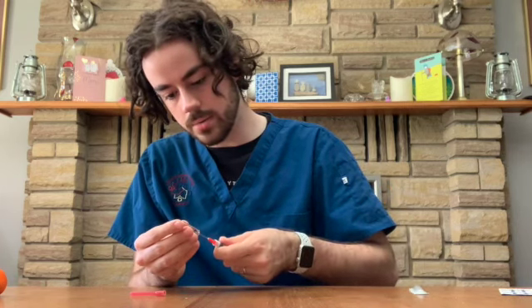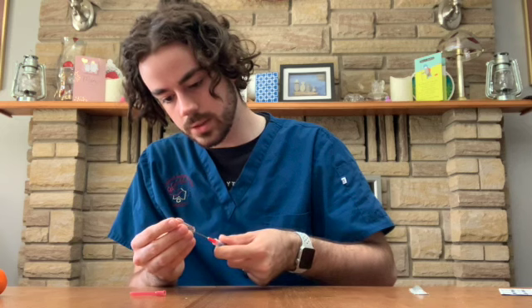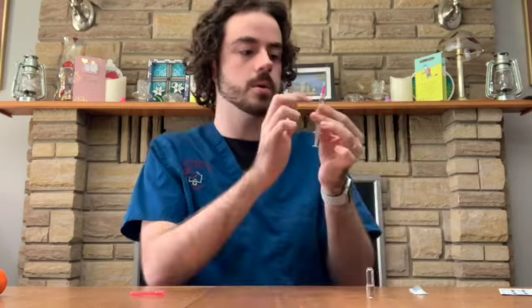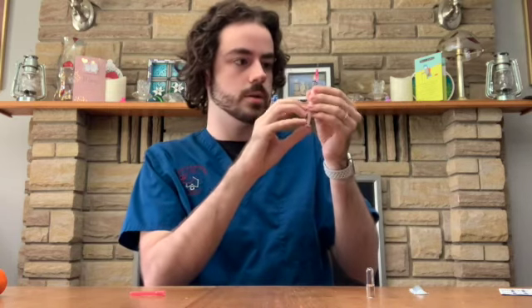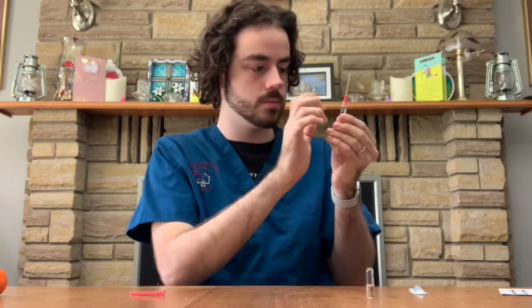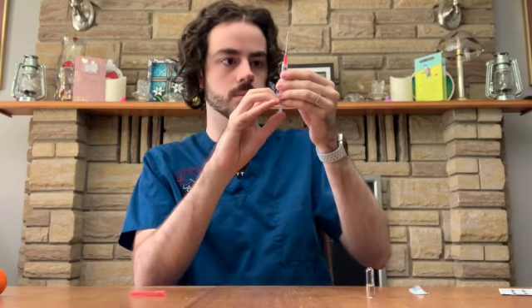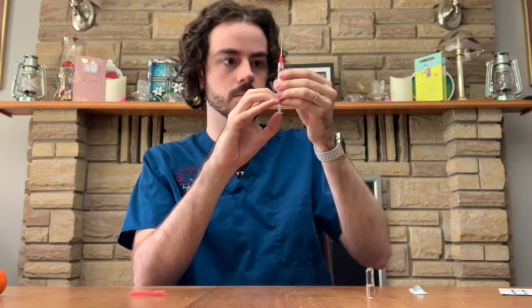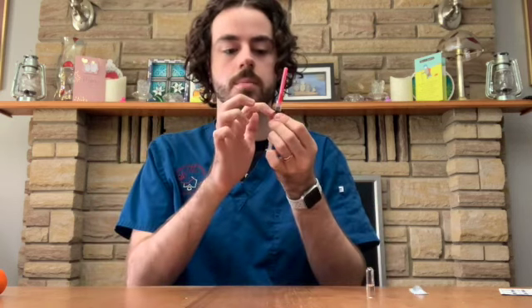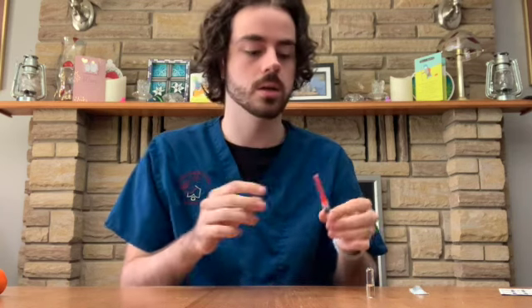And I'll draw up 0.5 milliliters. Just like that. Ensuring that there are no air bubbles. There's a big one in there right now. There we go. And again, I'm just lining up the rubber ring of the stopper to the 0.5 milliliter line.